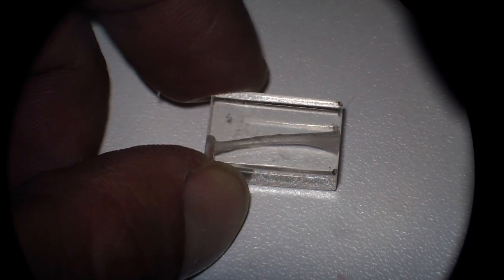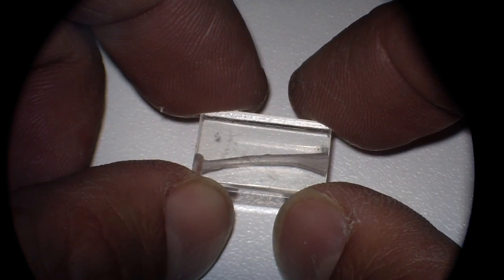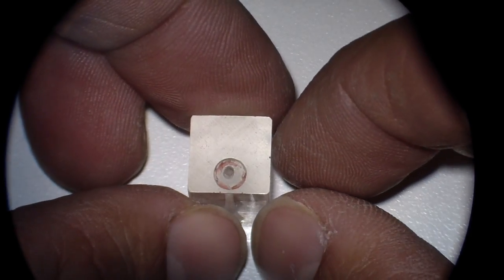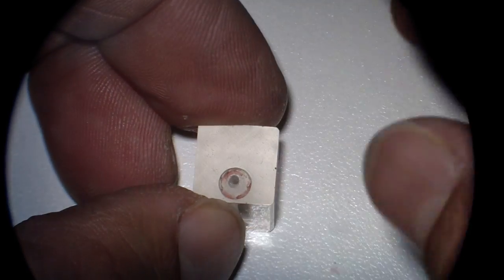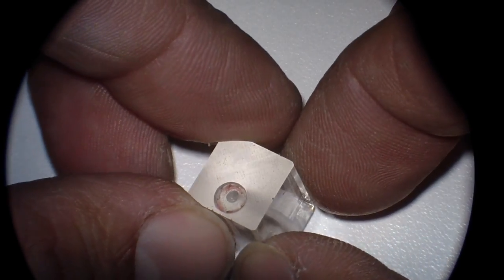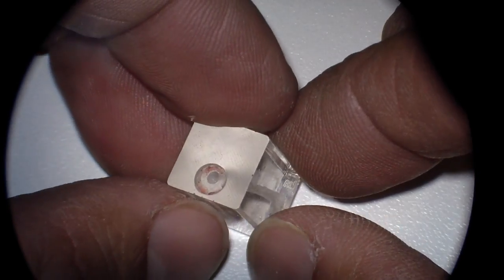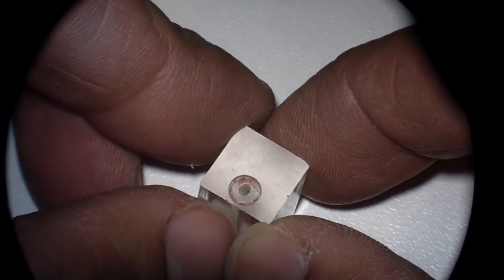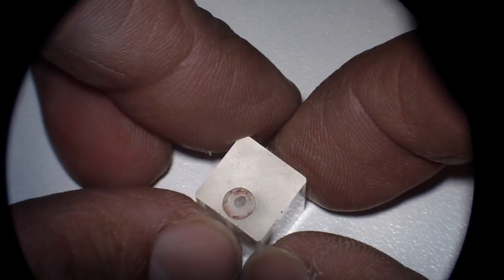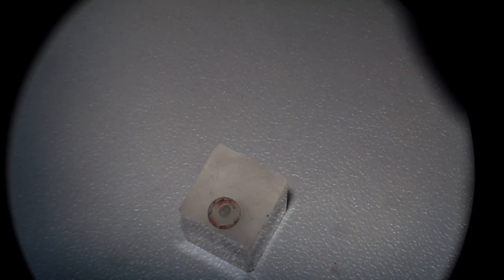Okay, so we're going to be using one of these clear endodontic blocks for purposes today of obturating the canal with MTA. And what I did, there's a little bit of red wax there from a previous shoot or take, I'm on take number 15. And what I've done is I've enlarged the canal to mimic something in the sense that it's more of a blunderbuss canal apically. So you can see that there, to mimic why we would be using MTA to obturate.